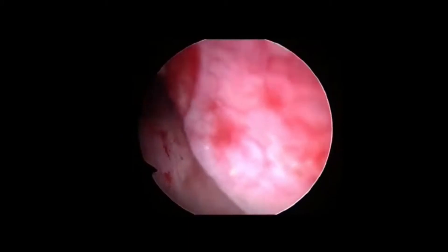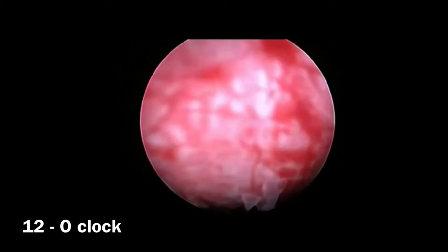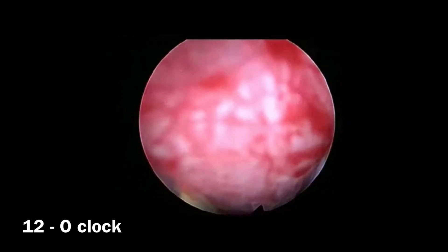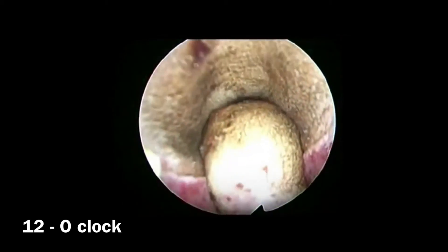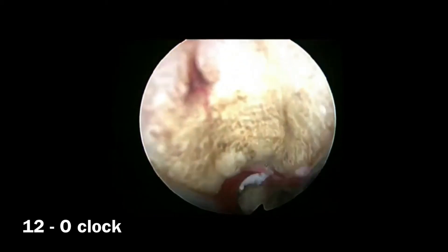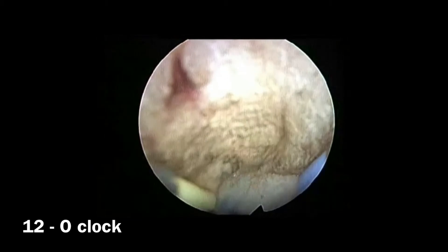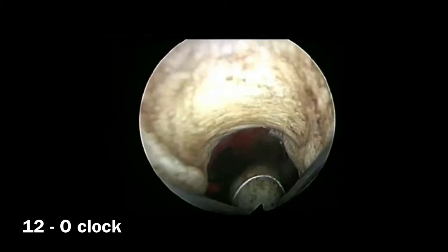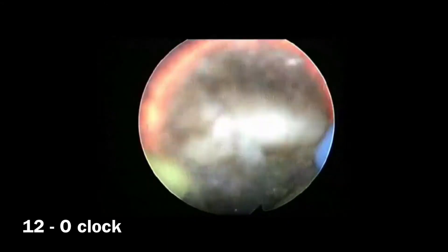Veru forms an important landmark in the resection. The resection is begun at 12 o'clock by placing the resectoscope at the level of Veru. The resection is proceeded along the capsule until the circular fibers of the bladder are made out. Beyond the circular fibers lies the capsule of the prostate, and injury to the capsule of the prostate is to be avoided.